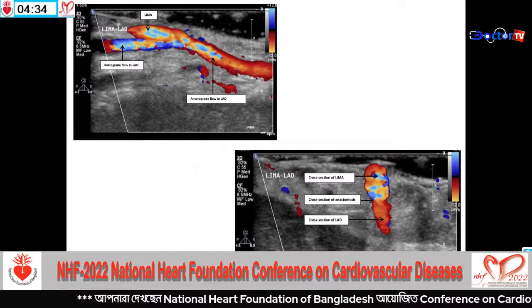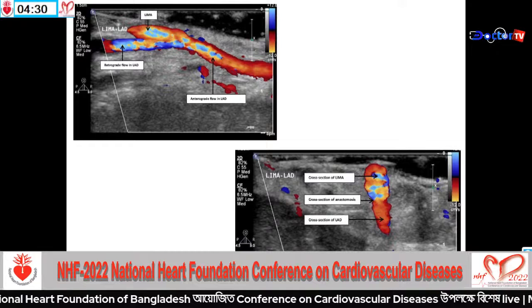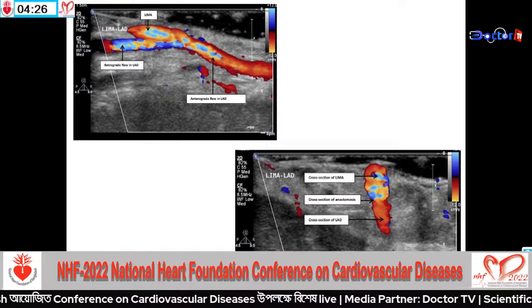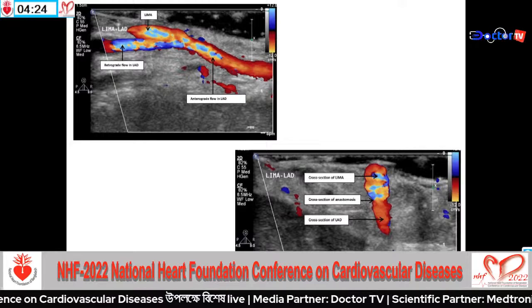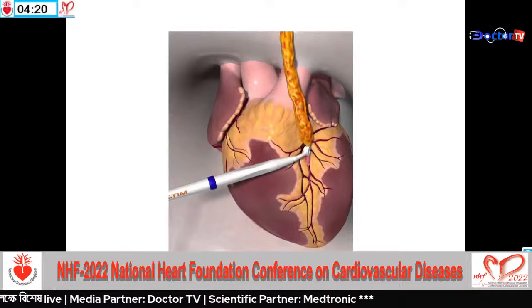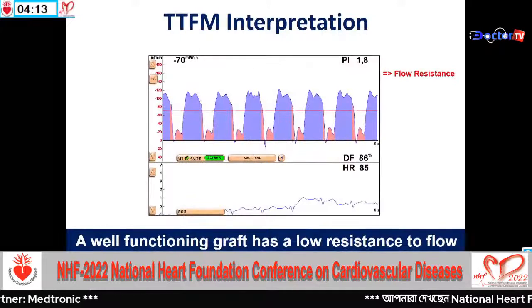It's very useful if you have an intramyocardial LAD. You can actually put the probe on the heart and see where the vessel is. You can pinpoint the LAD and make your cut there. We have all faced situations where we couldn't find the LAD and we had to dig a big hole in the heart and later regret it. And the other part of the probe, with that, you can actually measure what kind of flow you are getting.